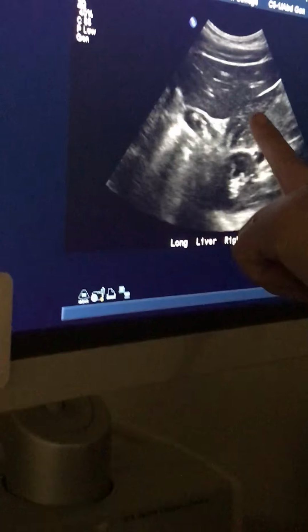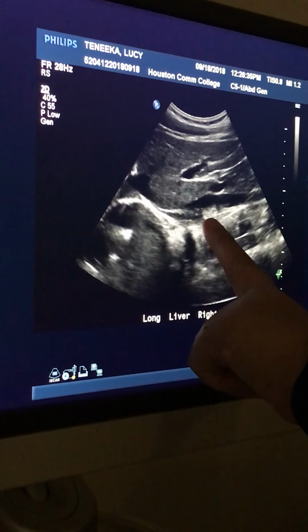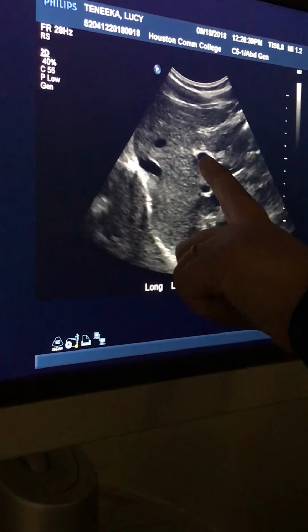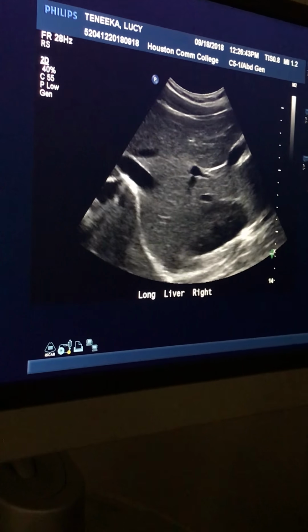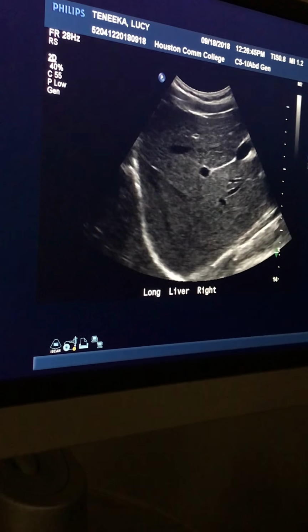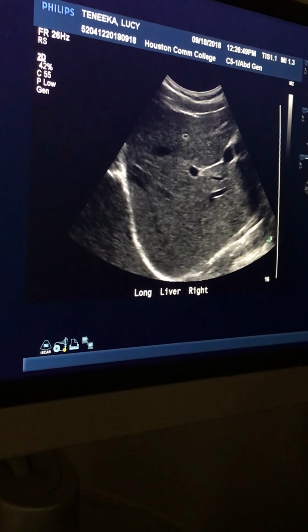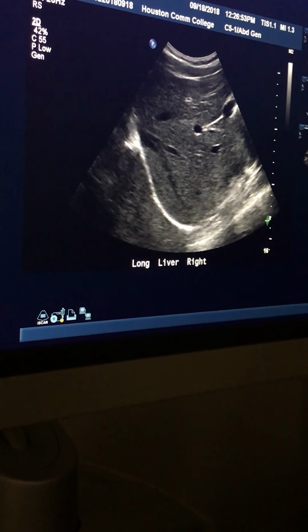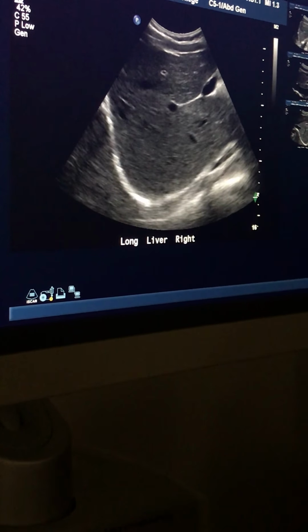So look, there's my left lobe picture. There's my aorta picture. There's my IVC. There's my left portal vein. I'm just going to keep angling to her right, and there's my right portal vein. And then I'm going to twist and get all that out of the picture. So there, where would the focus be? This is a little too close. I'm going to heel down a little bit, straighten it out right there. As I heel down, that kind of straightens my picture. If I toe down, I'm all crooked.